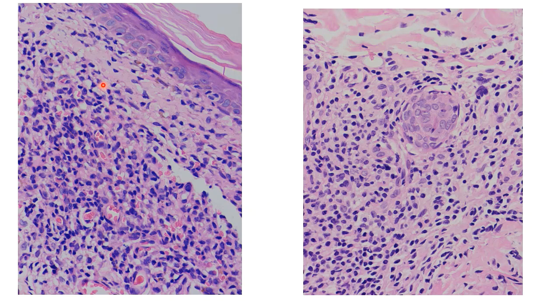It is a case of mycosis fungoides. Here we are seeing the upper dermis with atypical lymphoid cells which are infiltrating the overlying epidermis, known as epidermotropism, and the lymphocytes tagging along the basal layer. And these lymphocytes will show cytological atypia.